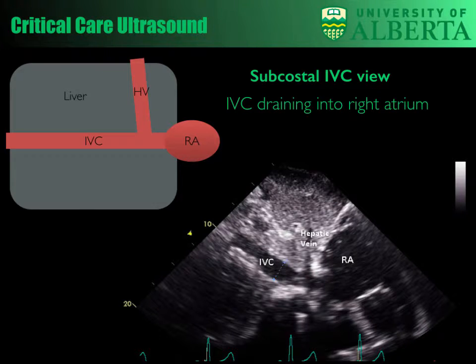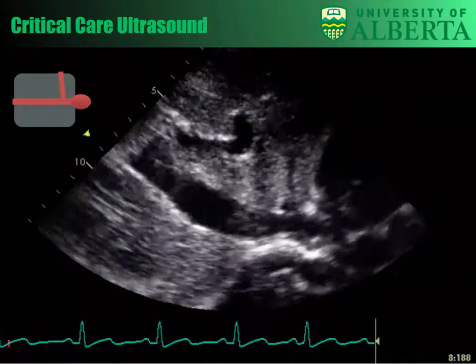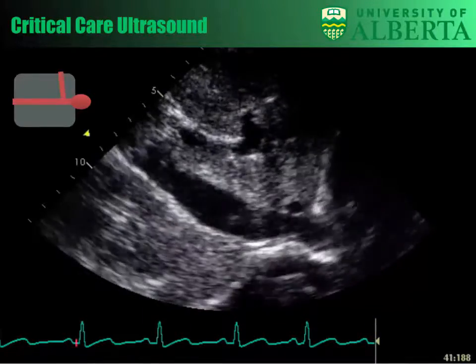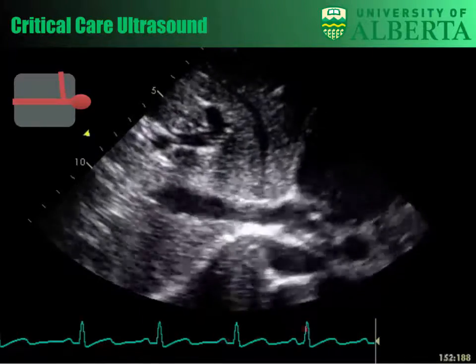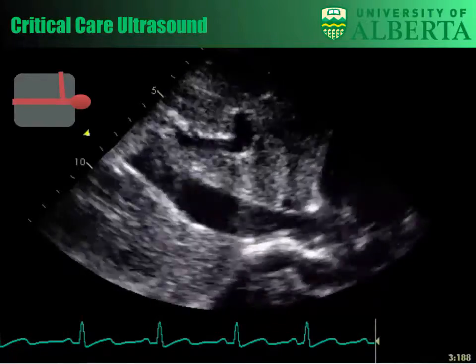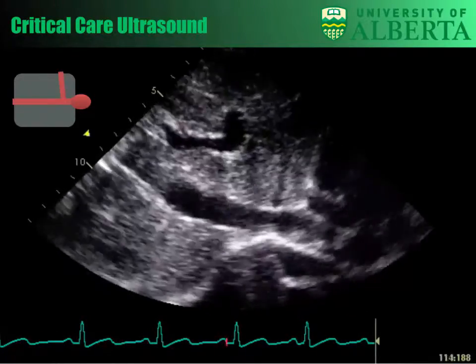This can be commonly confused with the abdominal aorta, which obviously doesn't connect to the RA, and is surrounded by hyperechoic intensities, which is often fat. So that's the IVC view, and in real time we can see it displayed here, going through the texture of the liver. We can see it connect to the RA. It often can be pulsatile, so that feature doesn't help you distinguish it from the abdominal aorta. So that's your IVC view.